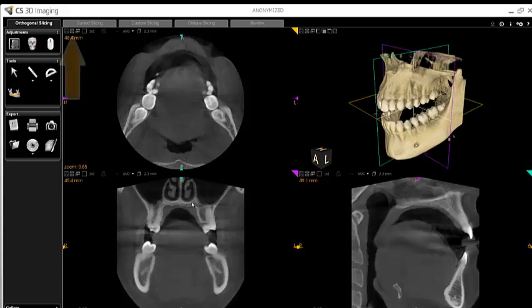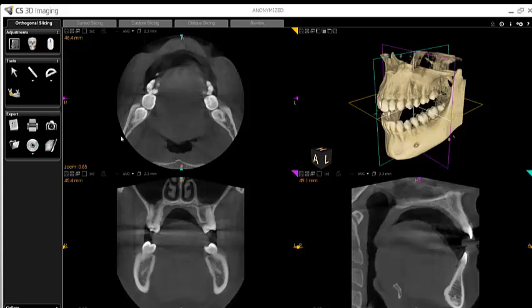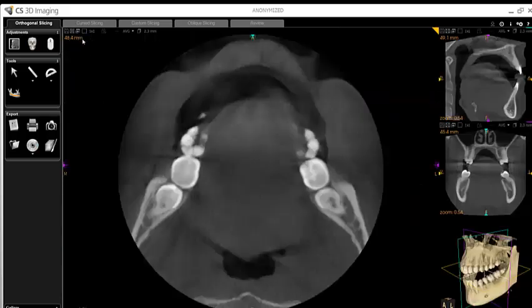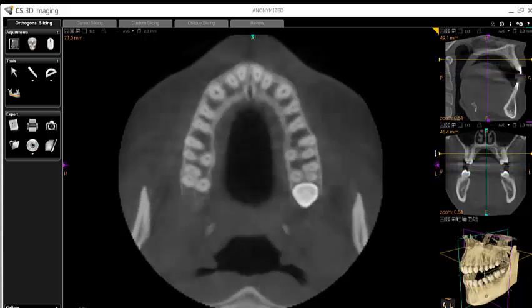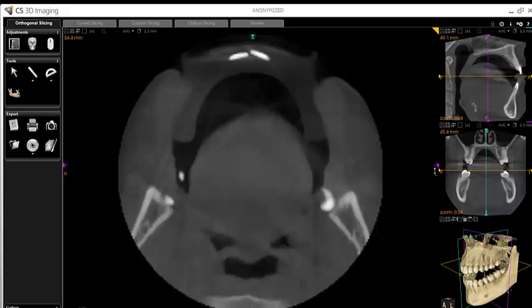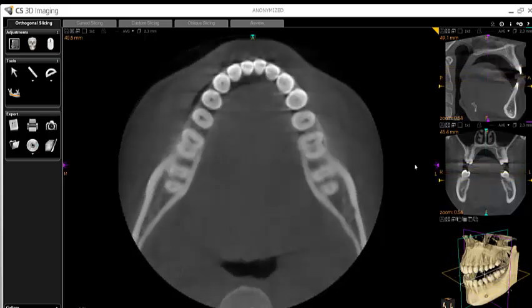Another important tool is the Maximize button. This button allows you to bring any viewing plane to full screen. Once in full screen, all other software functions are still available for use. To come back out of full screen, notice that the Maximize button has now become a Minimize button.